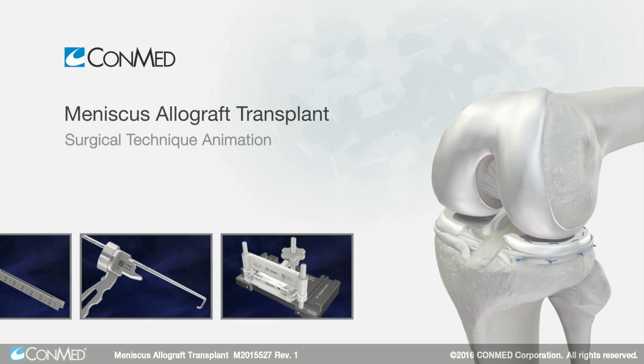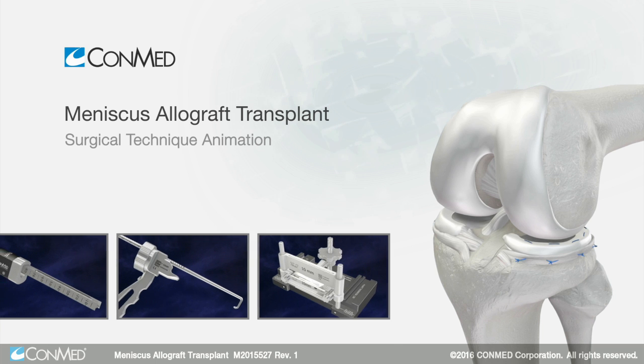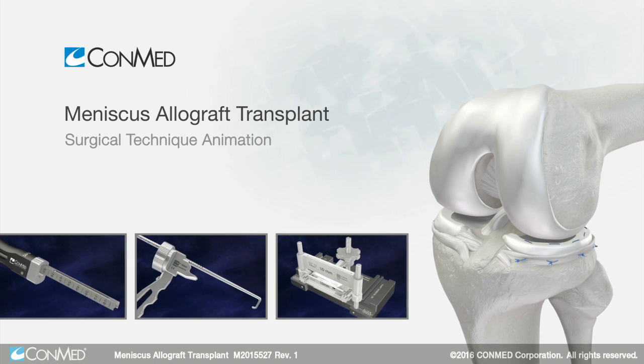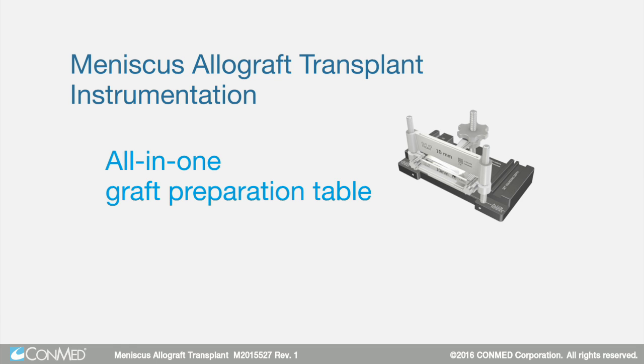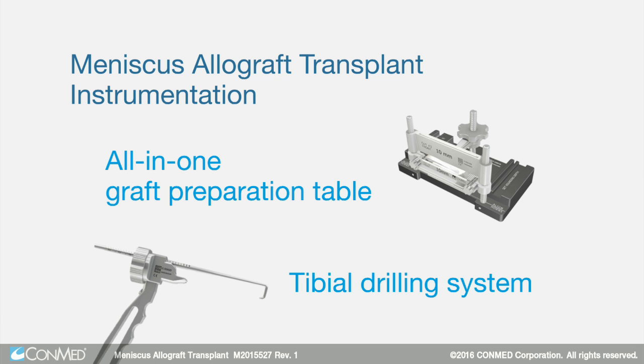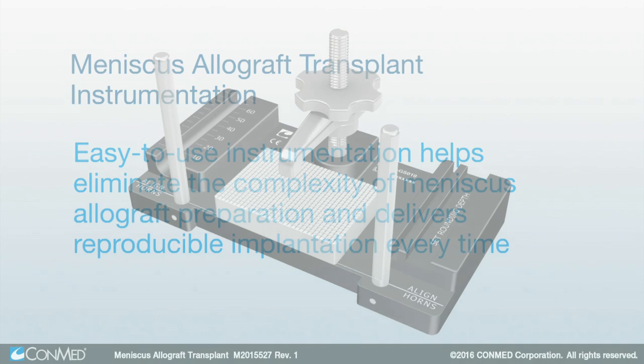The meniscus allograft transplant instrumentation is designed to simplify preparation and implantation. The instrumentation features an all-in-one graft preparation table and tibial drilling system. This easy-to-use instrumentation helps eliminate the complexity of meniscus allograft preparation and delivers reproducible implantation every time.